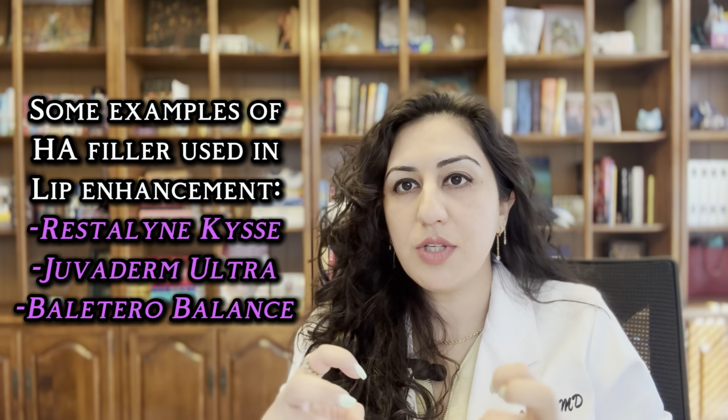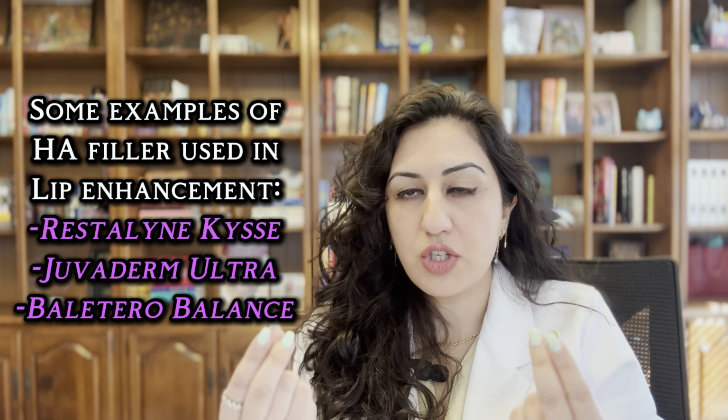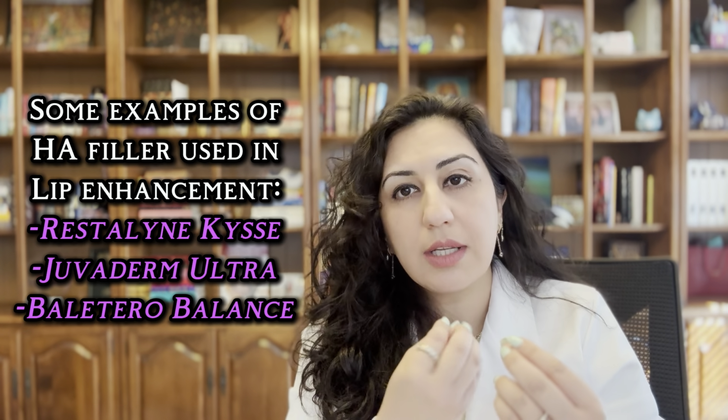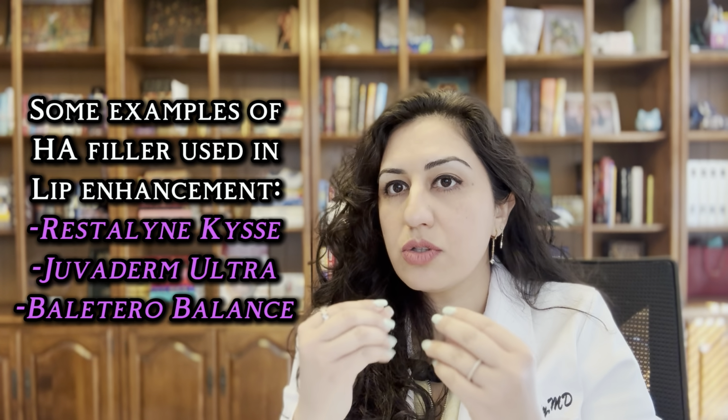So what you can add to sort of this facial balancing plan is some lip filler. Now, this doesn't mean you need to over plump and overdo it. No, you can still keep a patient's natural contouring of their lips if they want to maintain it. Sometimes this will also help improve hydration in the lips, which you lose with aging. But what this allows you to do is plump it just enough so that it makes sense in profile, okay? And it'll allow for the final result to all sort of come together nicely and more naturally, okay?